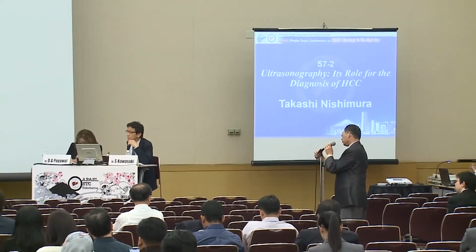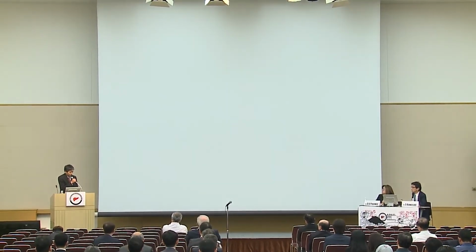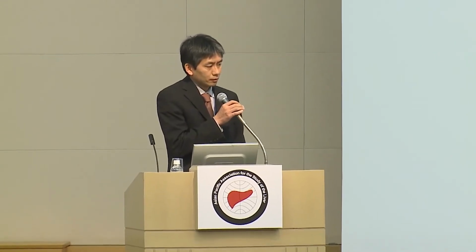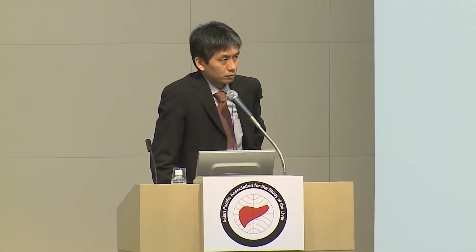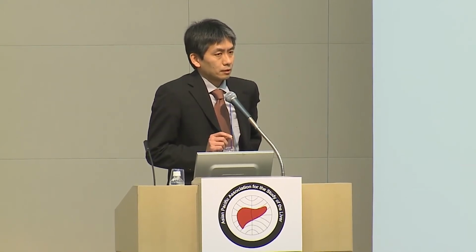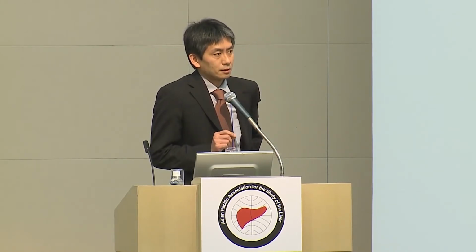Thank you. In our hospital, almost all patients undergo CEUS, but according to tumor size, more than 20 millimeter, I recommend performing CEUS, I think.